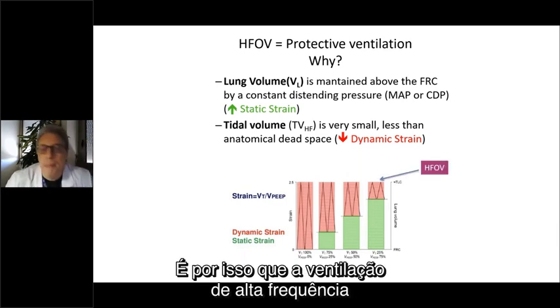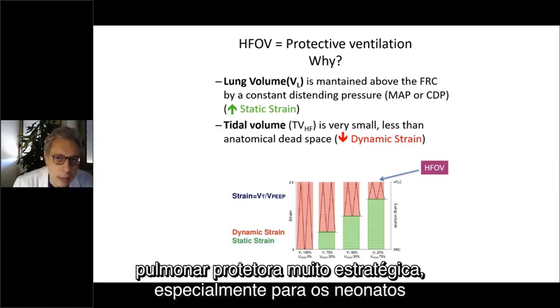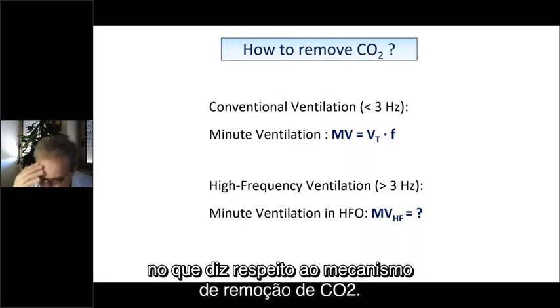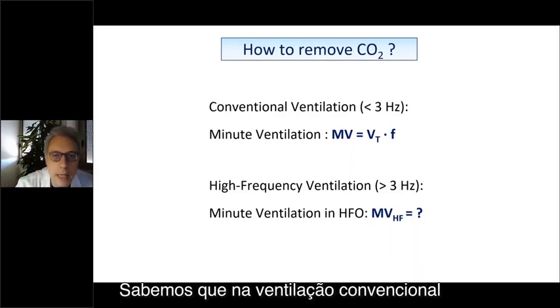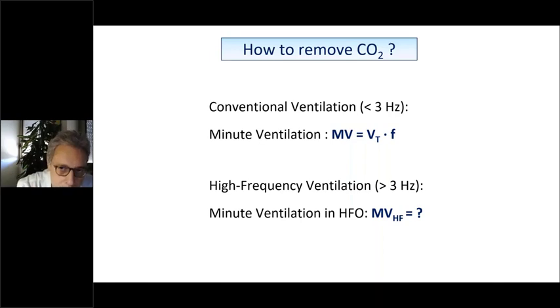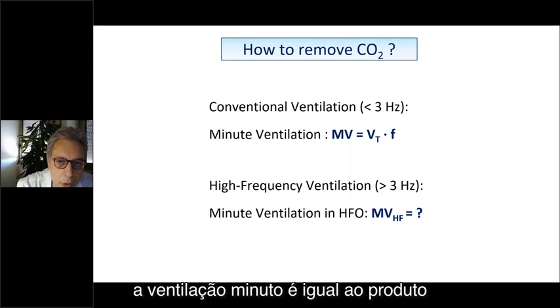And this is why high frequency ventilation could be considered a very strategic protective lung ventilation, especially for the neonates. Regarding the mechanism of removal of CO2, we know that in conventional ventilation, defined as all ventilation using less than 3 Hz, that is less than 180 breaths per minute, the minute ventilation is equal to the product of tidal volume times frequency.